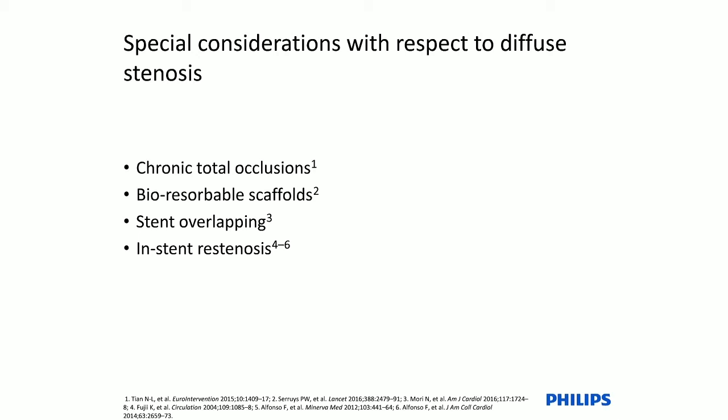Remember that the PSP recommendation that was generated for scaffolds was based on the association between malapposition of scaffolds and stent thrombosis that was clearly noticed, or even improper expansion of the vessel due to improper understanding of the nature of the underlying disease, and therefore leading to improper plaque preparation.